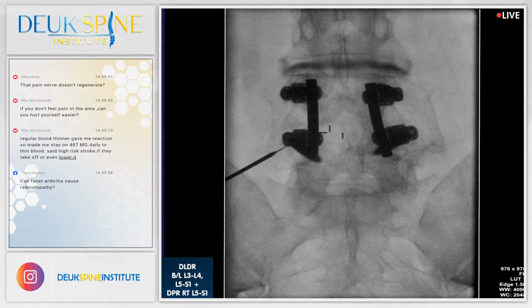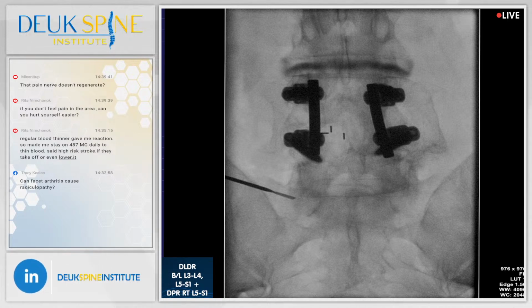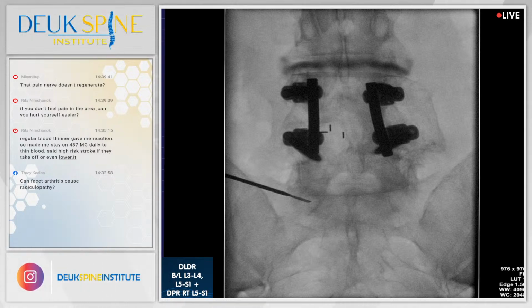All right, one down, one more to go. The scar tissue that we're talking about is from the fusion. He had that fusion done, I don't remember exactly where, but it was maybe in Kansas. And unfortunately, fusions create a tremendous amount of scar tissue around the spine from the surgeon basically getting bleeding and cutting through tissues. Shot. Too medial.